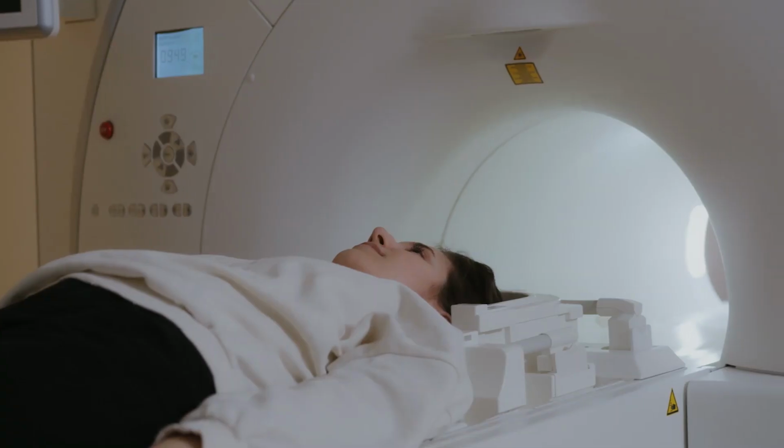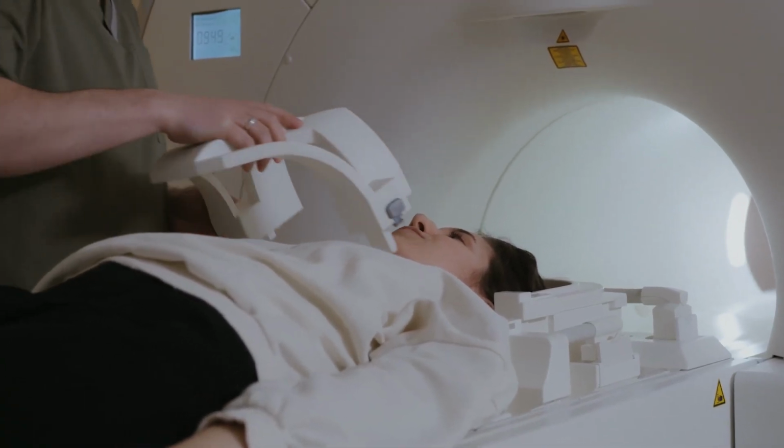Now everything's become digital today, right? In the same hospital, when you do an MRI scan, a CT scan, or an X-ray, each of these has tons of metadata to it: name, age, date of birth, sex, blood group, for example, or even insurance details. Everything gets tagged to something called a DICOM. It's a digital format that gets moved around inside hospitals today. I think it's pretty fast also. There's a benefit that we have seen with everything being digitized. You can get the report on the same day. Absolutely, quite convenient for users.